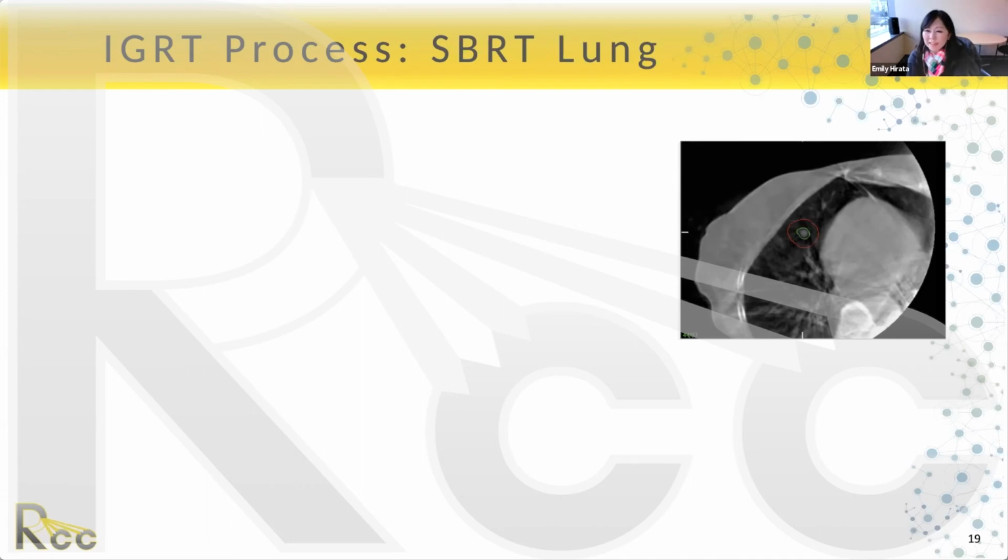I'm sure there are clinical cases where we've rotated more than that. And basically, I think as a program that's starting up, these thresholds that you're going to want to develop are going to be based on the experience that you have. So definitely you want to be at the console for all of these images. Your record and verify system will collect the rotations that are applied so that you can see for your SBRT patients, as you develop a patient base, where are you seeing most of the rotation, or what is your average couch rotation? And then you can set some guardrails or some limits on that for your therapist moving forward.